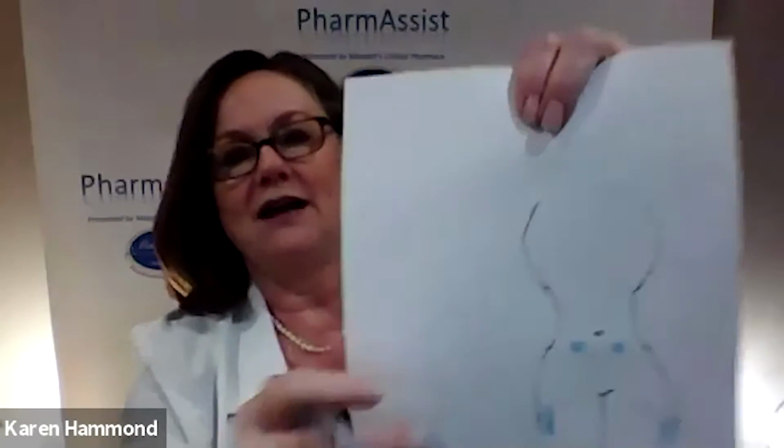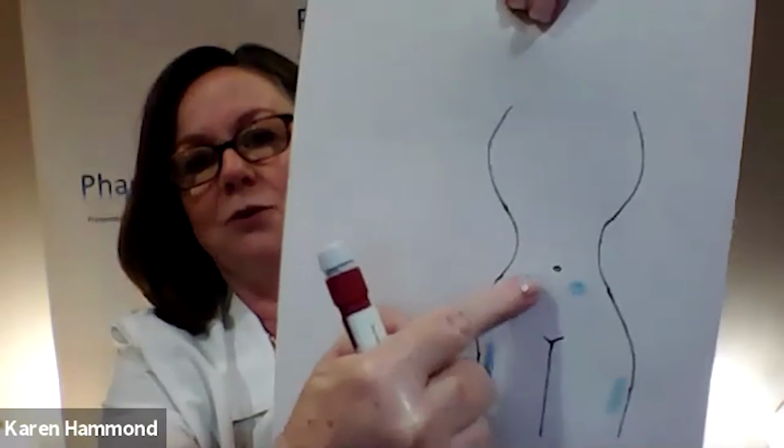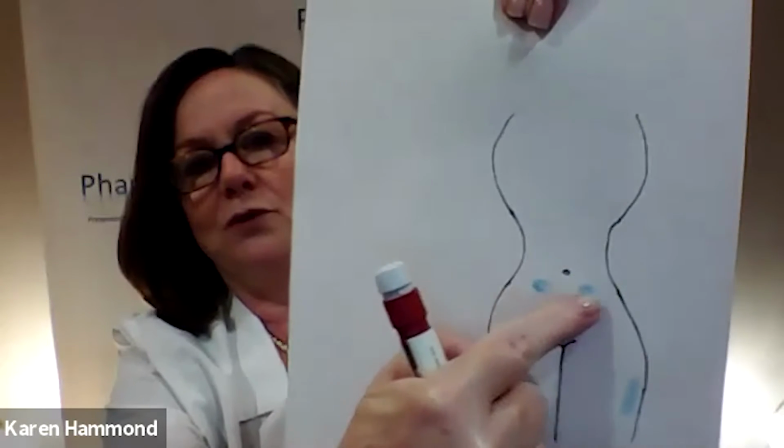To do this, just choose your site first. If you want to give it in your abdomen, you should go someplace around your belly button, like where these little blue areas are, or either in the outer part of the thigh. Anywhere really that you can pinch an inch. Then you pinch up the area because you want to make sure it's going into fat.